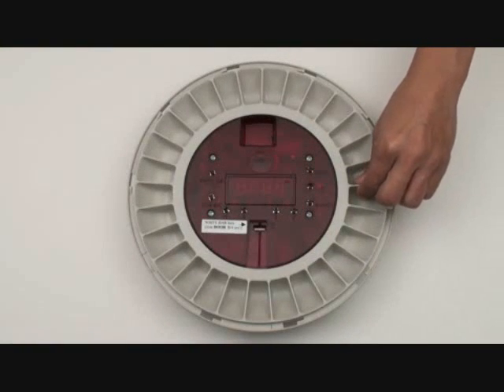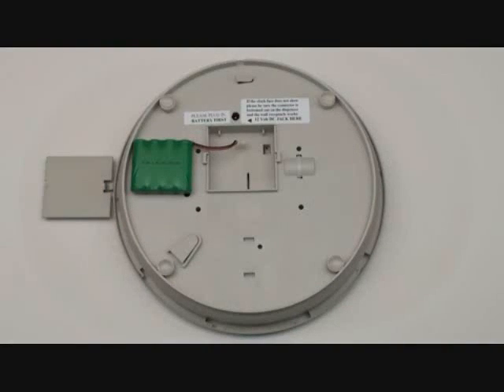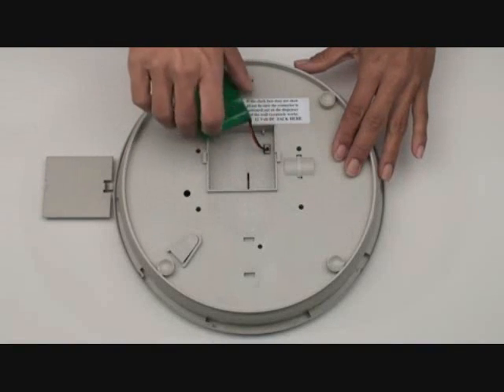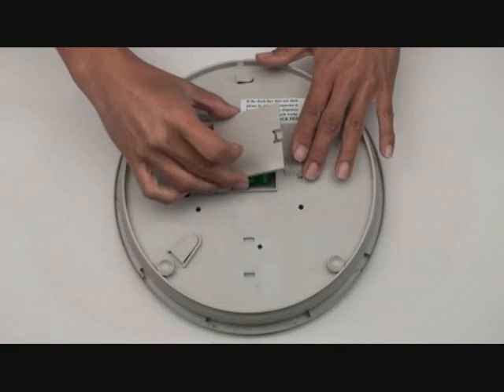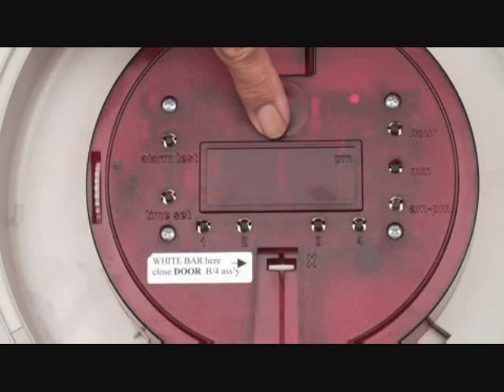To start, remove the pill tray. Turn the unit over and locate the battery compartment. Open the compartment and insert the battery. Note that the design of the plug allows it to enter in only one direction. Replace the battery compartment lid. To verify that the battery was installed correctly, turn the unit face up and verify that only the colon is flashing.